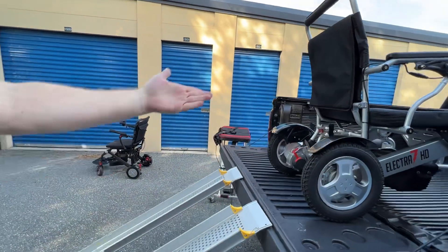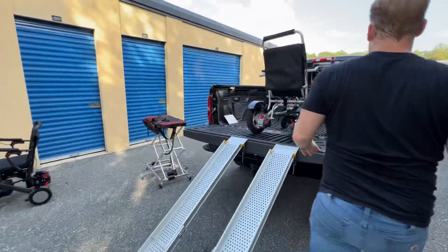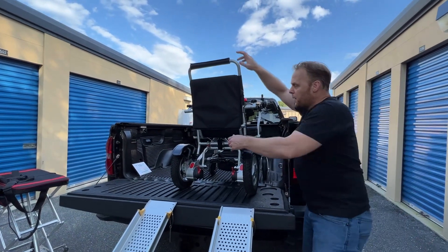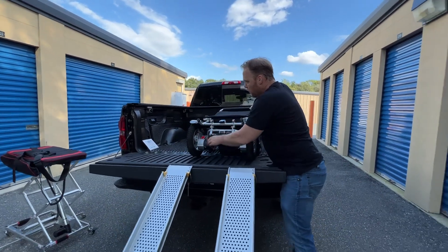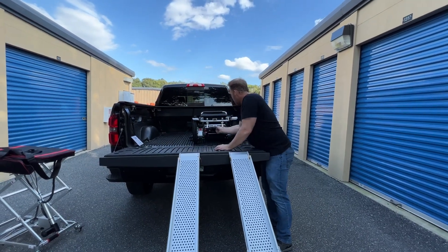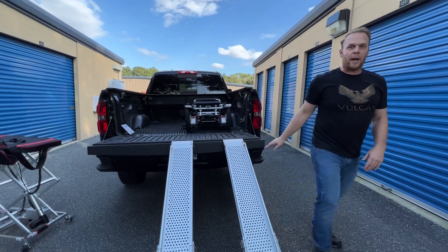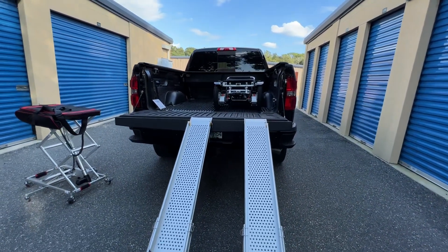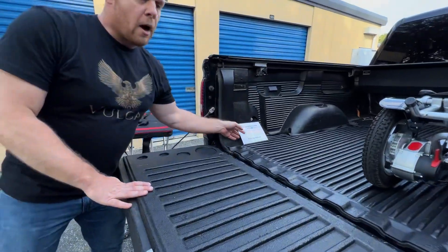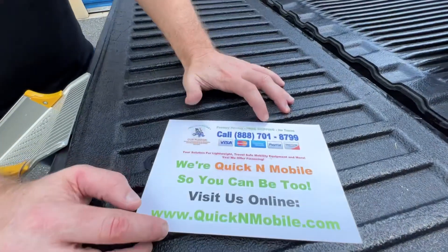Now all I have to do is fold the chair — turn the joystick off first, because if the joystick's on it won't go into freewheel. Fold the chair, put it in freewheel, scoot it up, lock the chair, and there I go. Then just address the ramp. So you get an idea of both using a Vulcan lift or using a lightweight ramp.